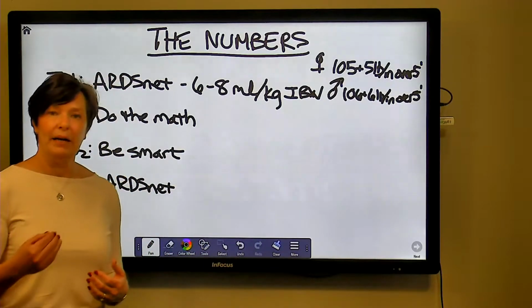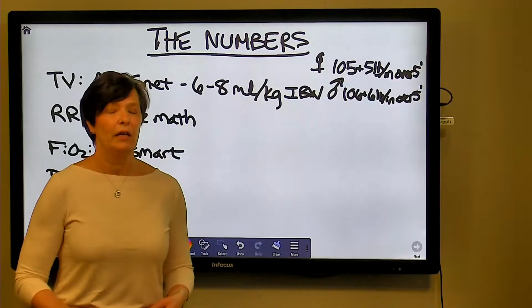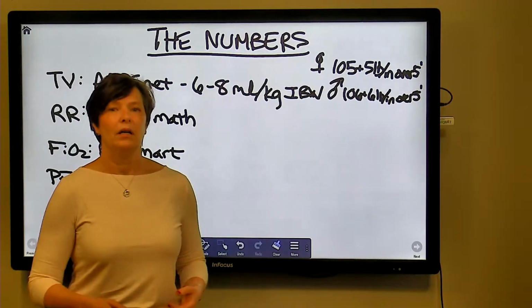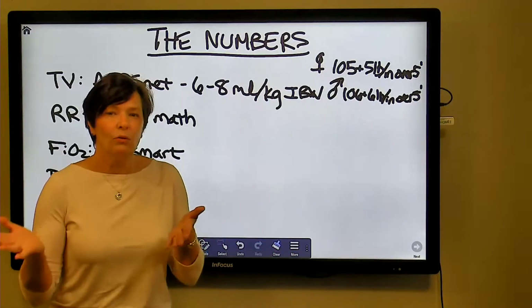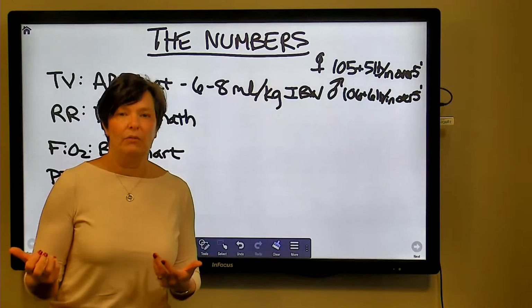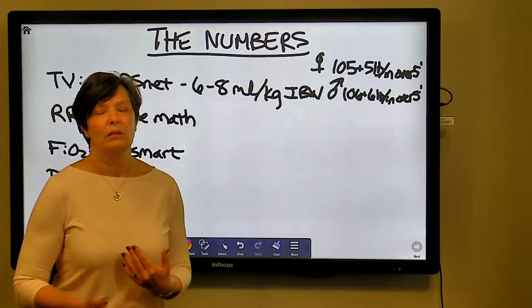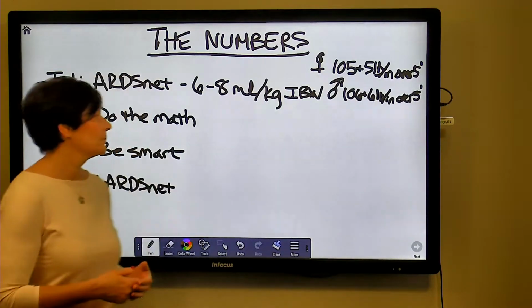However, if you get a patient in who is developing ARDS, has pneumonia, CHF, and they come to you on a 100% non-rebreather, you're going to start them at 100%. So think about what this person is coming to me with and what they need. You don't need to start somebody with absolutely normal lungs on 100% FiO2. Just keep them low. It's better for them.